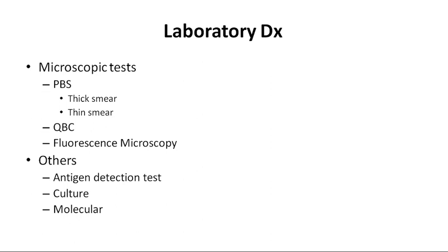Let's see the diagnostic options available for malaria, which include microscopic techniques like making a thick and thin smear from peripheral blood examination, quantitative buffy coat, fluorescence microscopy, as well as non-microscopic techniques like antigen detection test, culture, and molecular methods.